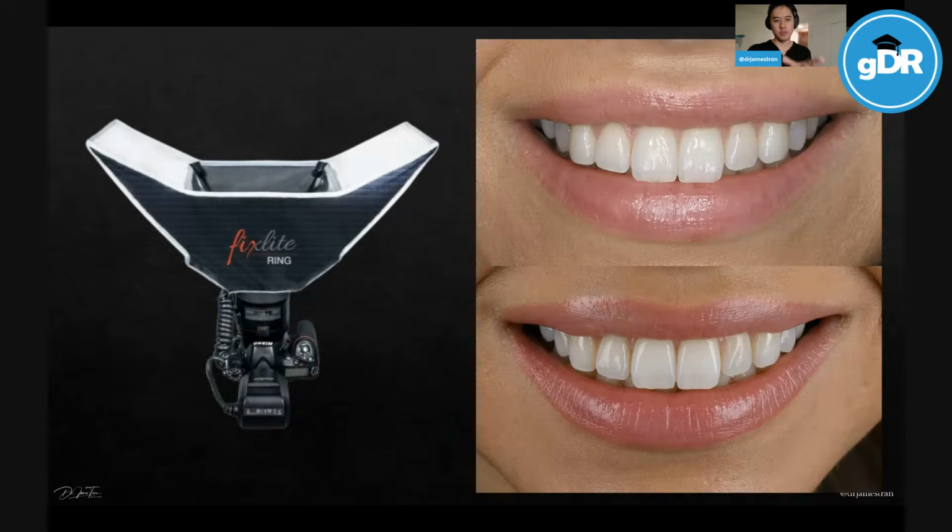This is an alternate version that you might have seen from the Dr. Camera Pop. It's a converter. It converts the light and splits it into two beams to mimic a twin flash. Also a very good option as well. It's just very big. Too bulky for me, but it wows the patient. They go, oh my God, look at this huge thing.